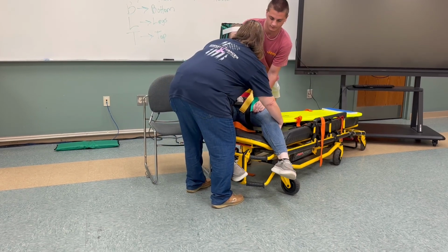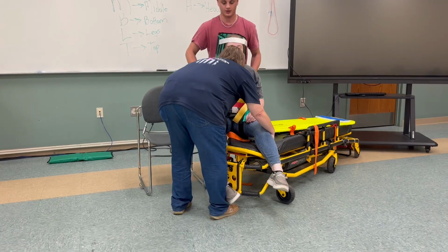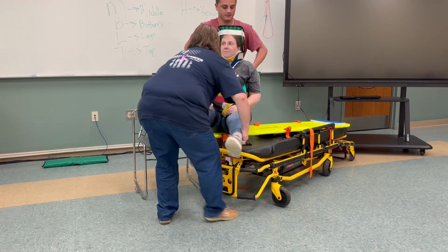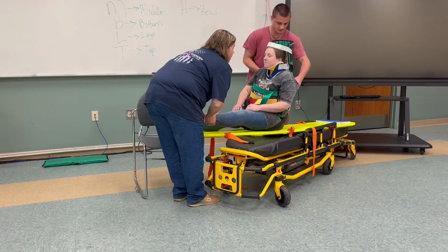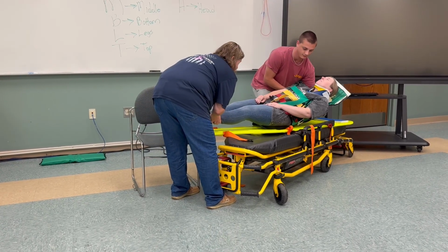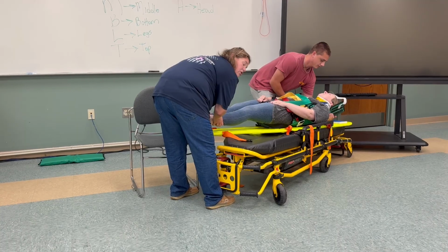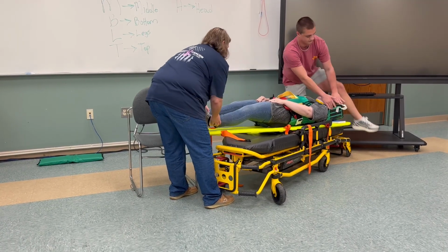And you can grab both straps on the back and I have her legs. Okay. Ready? 1, 2, 3. And she can move that. Go ahead and hold C-spine. Sometimes the Velcro will come undone. So we need to make sure that it stays proper.